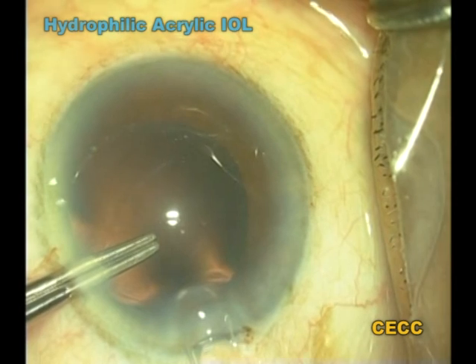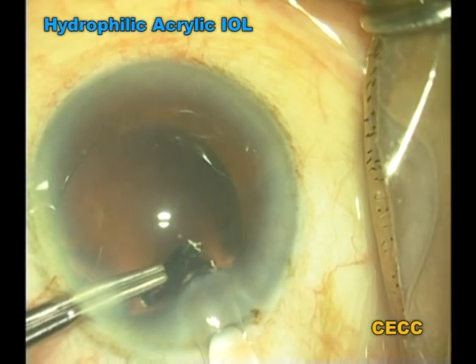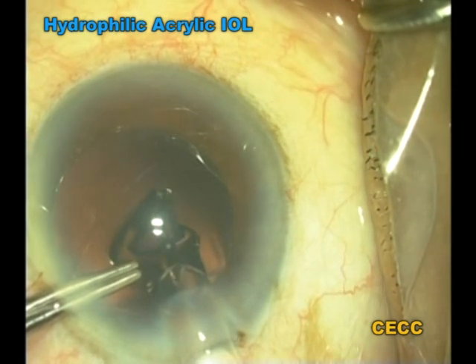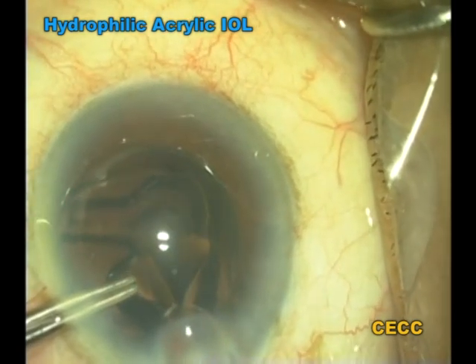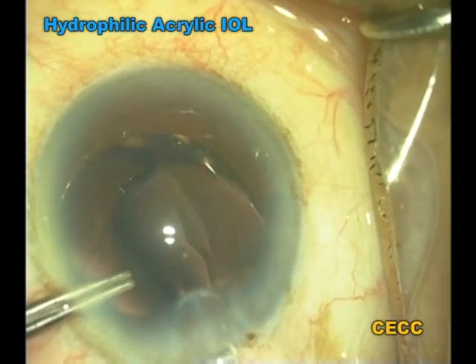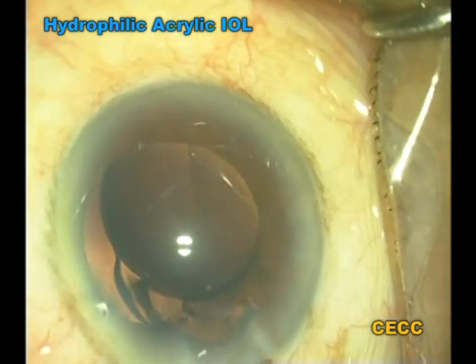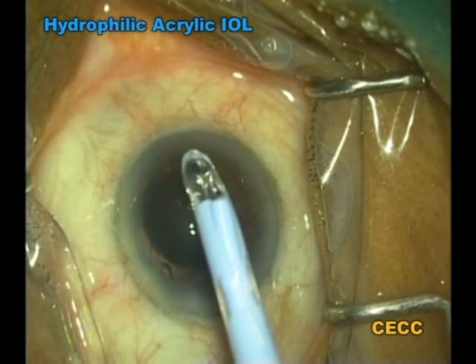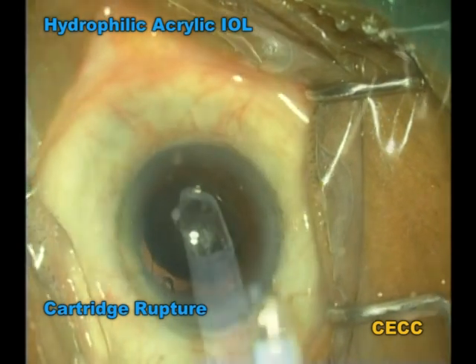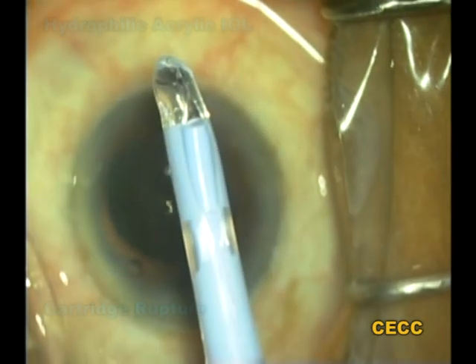The next complication deals with a hydrophilic acrylic intraocular lens implantation. Here, some resistance was encountered during the lens insertion which was initially ignored. The trailing haptic release was rather sudden. Post-implantation inspection of the cartridge tip revealed a rupture of the cartridge wall. The mismatch in the optic thickness and stretch limits of the cartridge perhaps resulted in rupture of the cartridge extending for a significant distance from the tip.